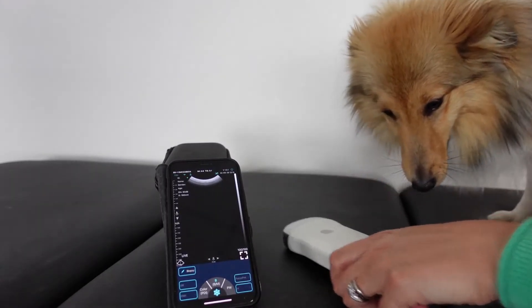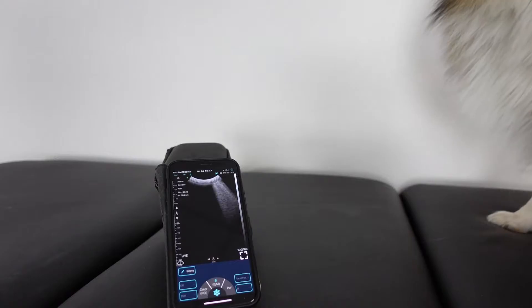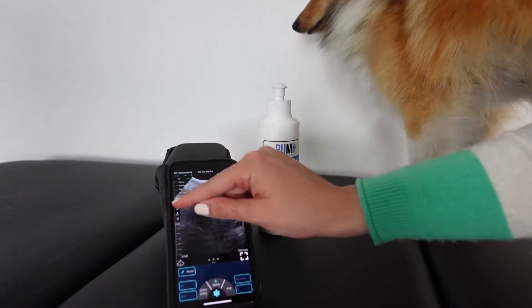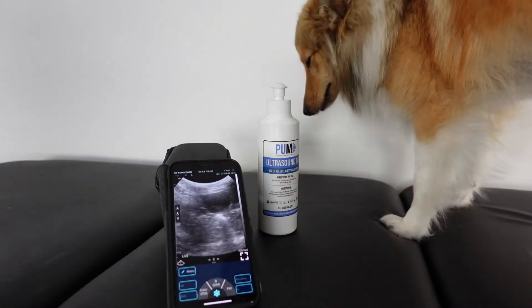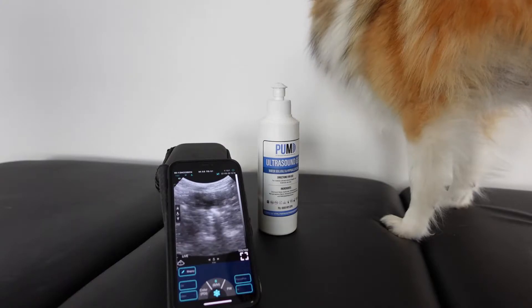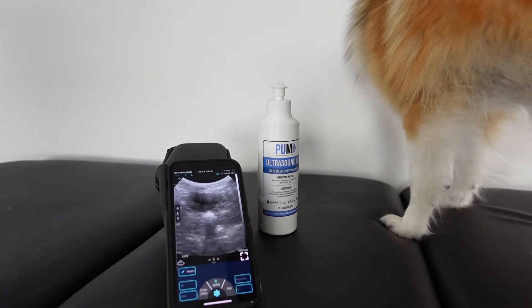This entry-level pulse echo convex probe has 80 elements and is priced around $1,300 or £1,300. Imaging really is very coarse. It would work for cystos and spotting free fluid, but it's difficult to imagine how else it could be applied at a veterinary level.